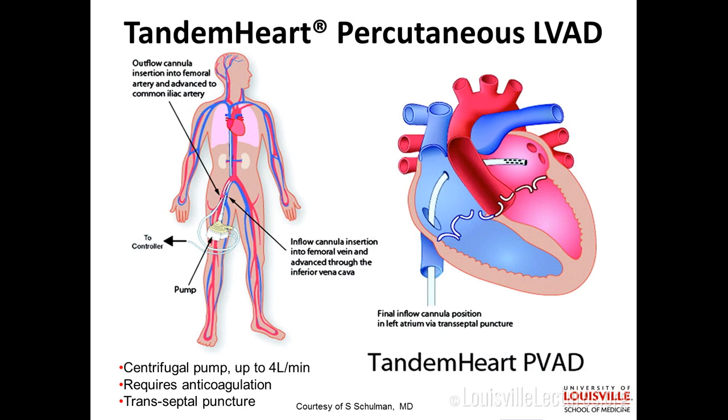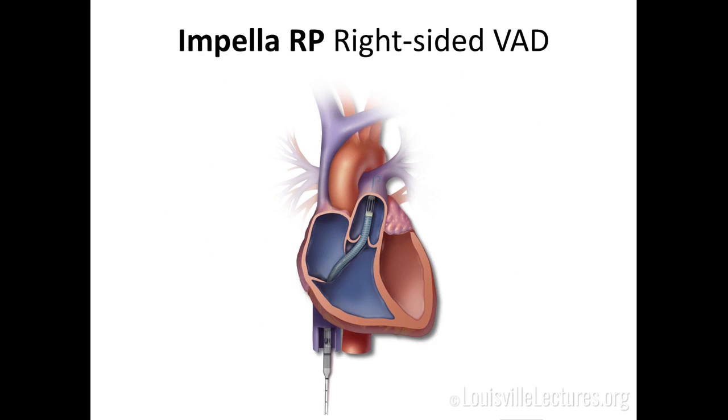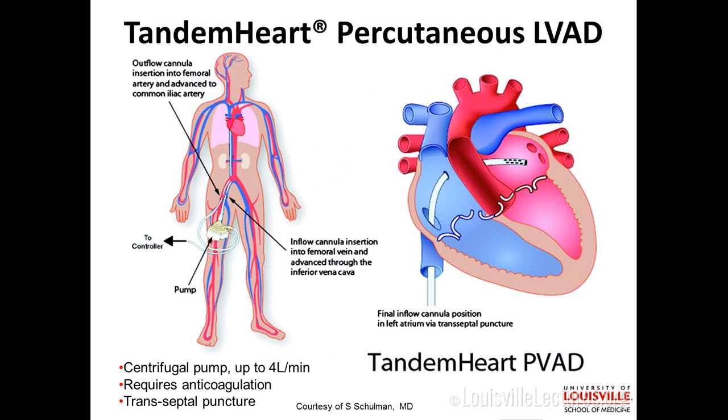Okay, any questions about Impella, either of those things? Again, this is just for fun. It's exciting so you can see that these devices are available. Tandem heart is used in some centers where they have a lot of experience with it. I've only had one episode with this ever.